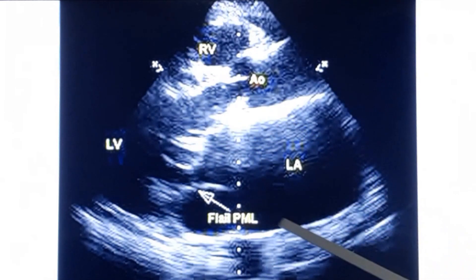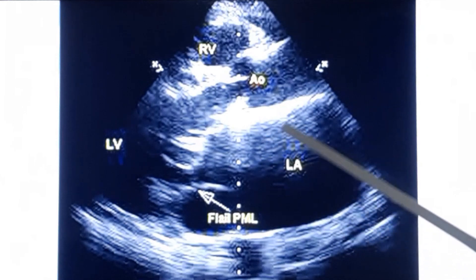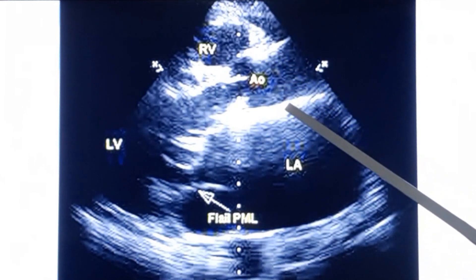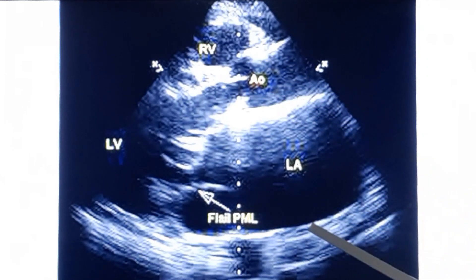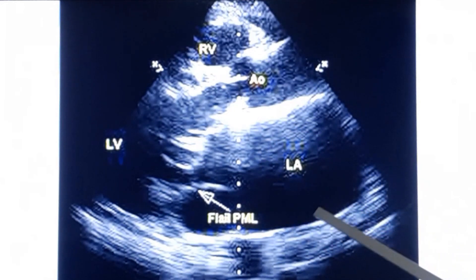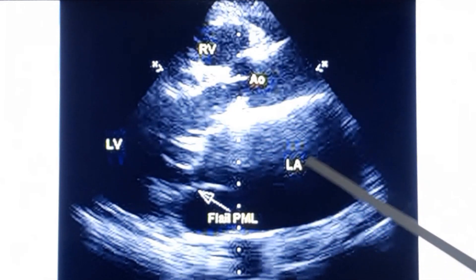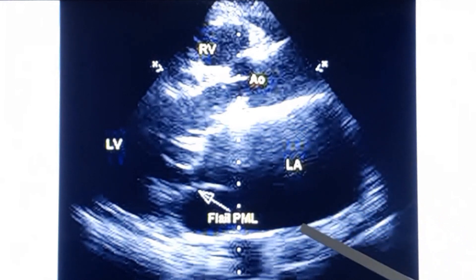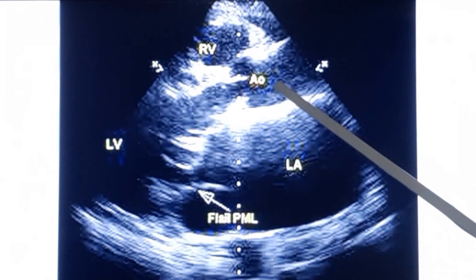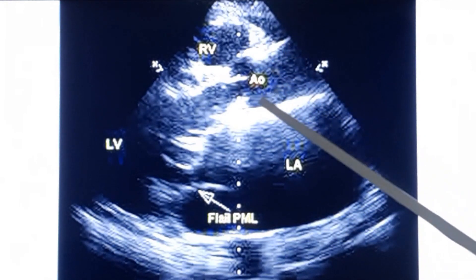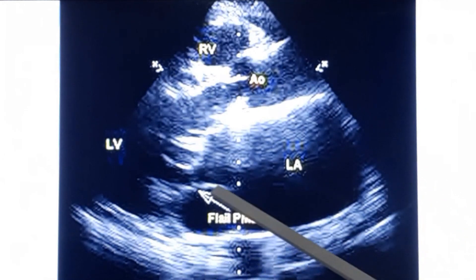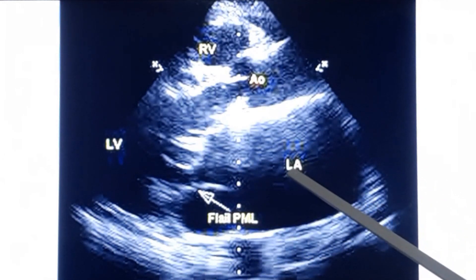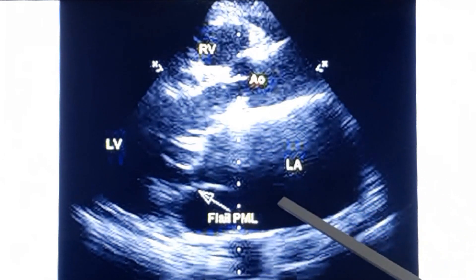The left atrium is dilated. Usually the diameter of the aorta and left atrium are almost equal. Here you can see that the left atrium diameter is almost double that of the aortic diameter, and this is due to mitral regurgitation.